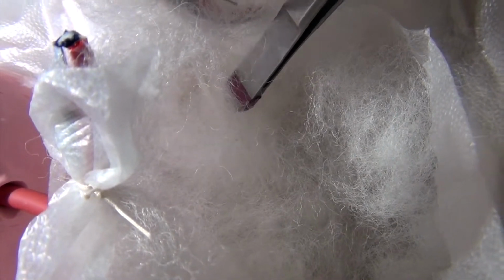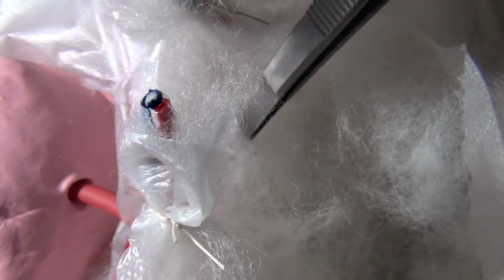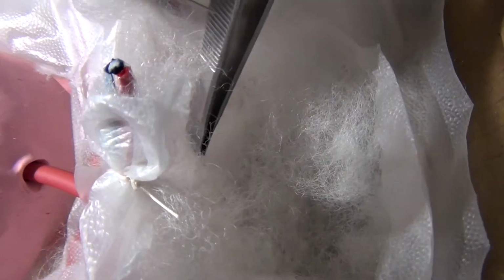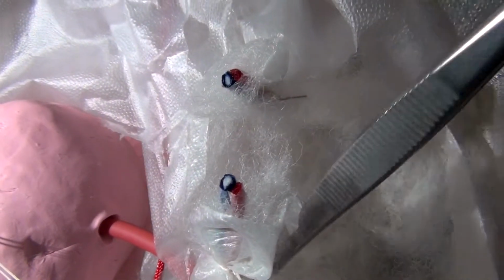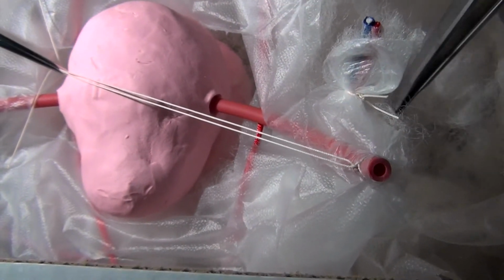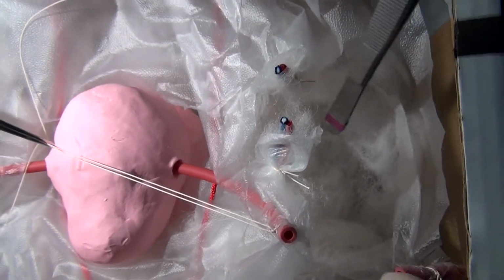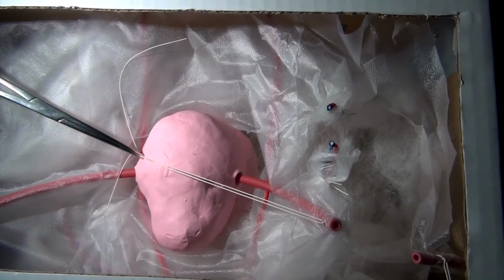And there's our ureter, which again, remember, starts at the pelvic brim, crosses over the common iliac laterally, and then moves its way medially to dive into the posterior sheath of the broad ligament. And then it continues to dive where it's about 0.5 to 2.5 centimeters from the uterine vessels, and then continues medially to dive into the posterior aspect of the bladder. And this is important anatomical knowledge that is needed for the expert surgeon in complicated laparotomies.